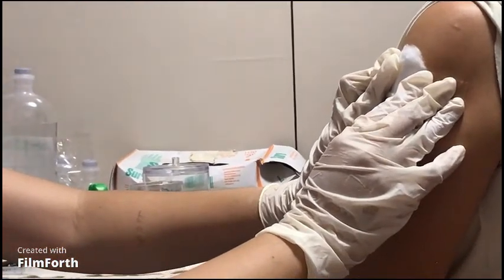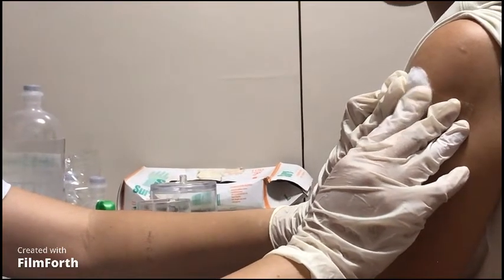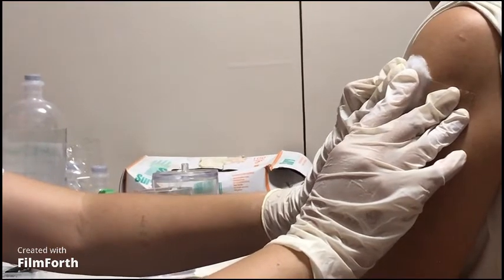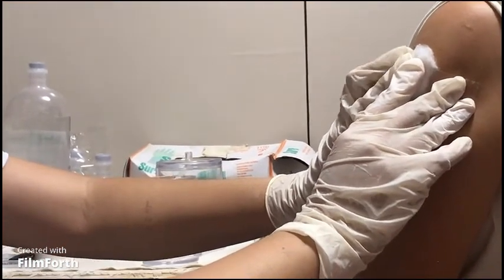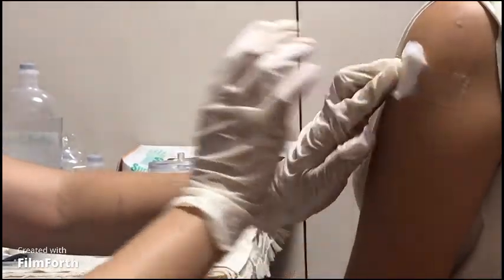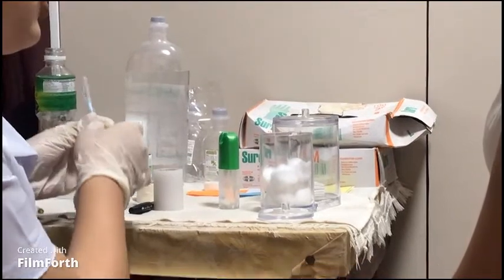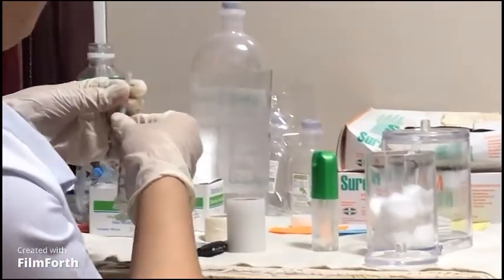Withdraw the needle, moving smoothly at the same angle of insertion. Apply gentle pressure at the site with a dry sponge. Do not massage the site. If bleeding occurs, apply pressure with a dry, sterile gauze until it stops. Discard the uncapped needle and attached syringe into the proper receptacle.